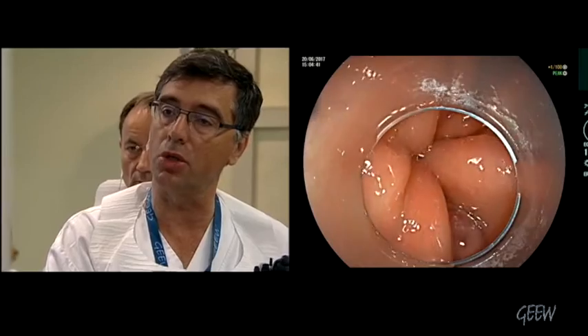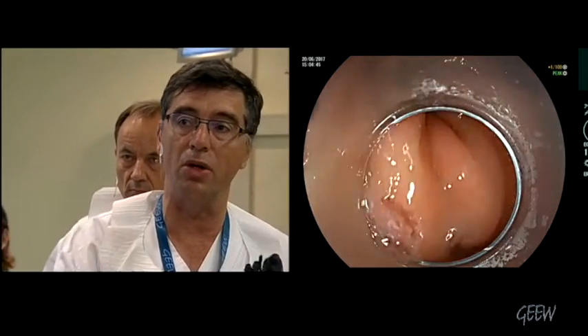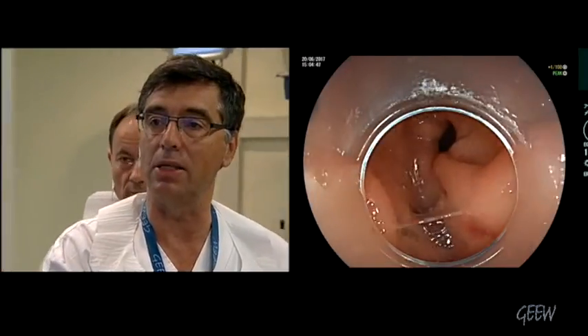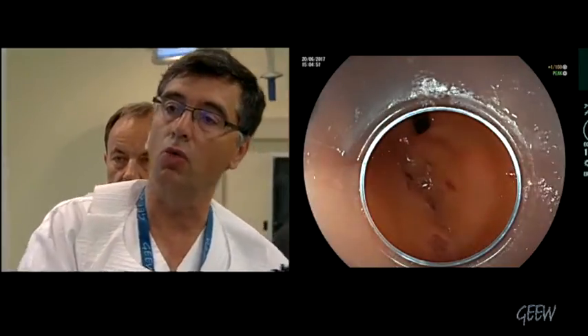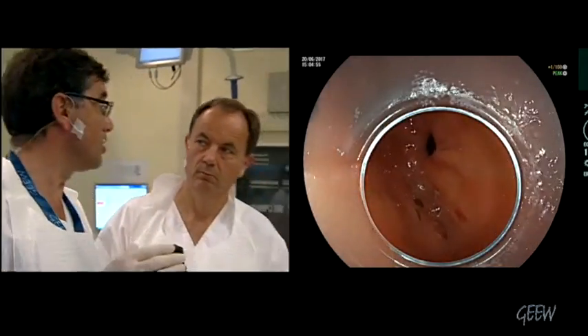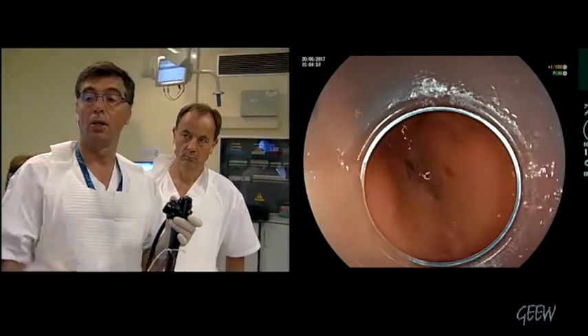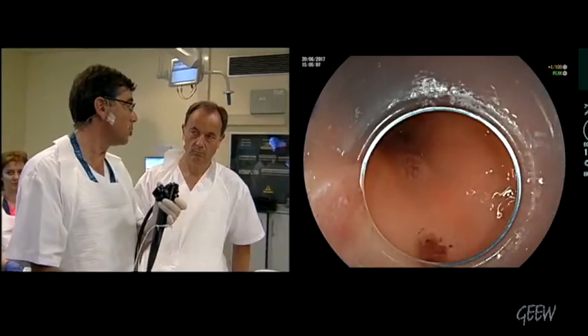We discuss with Horst about the exact place for doing the mucosal entrance. You can increase the anesthesia because the patient is moving a lot. Usually we do it at three to five centimeters from the pylorus, in the axis of the greater curvature. I think you are doing the same.